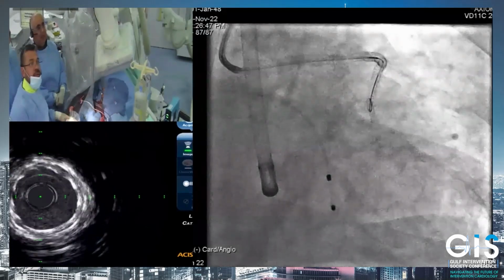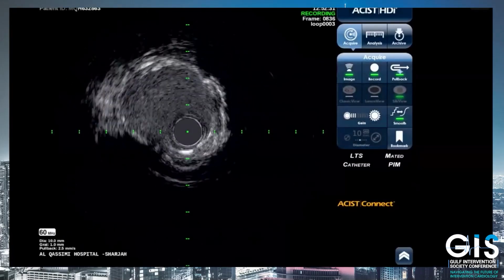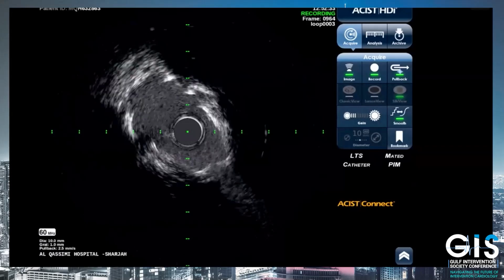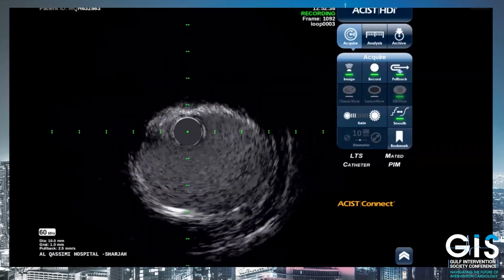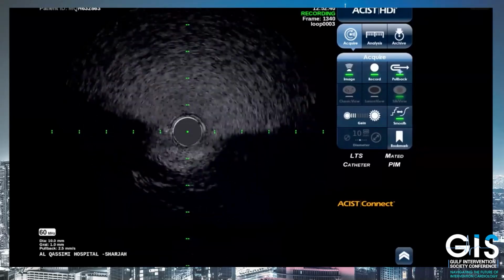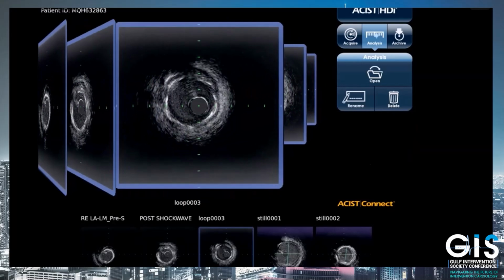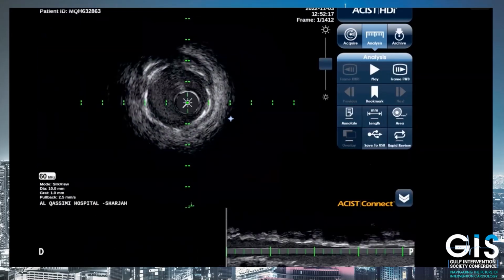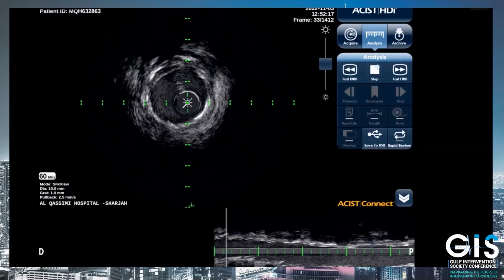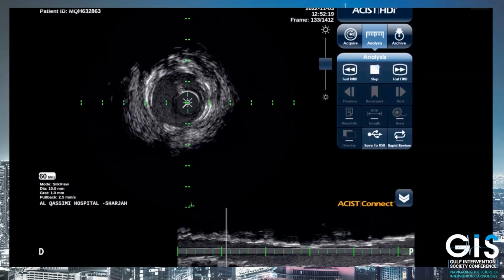I tell you, Mohammed, one thing. First of all, this is an open cell design. This is a single wire stent, and the access to the circ will be really no challenge. We can see here the access of the ostium of the circ we saw just now, quite patent, and there's no dissection. This lesion was there from before, and I don't see any really significant carina shift there. This was from before. The flow is 3. We will call the patient certainly as an outpatient and follow him up.